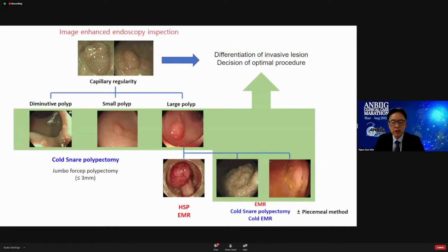Summarizing the recently published studies about polypectomy and EMR, the cold resection techniques are continuously expanding the indications for benign lesions without submucosal invasion, especially in consideration of safety and cost effectiveness. However, as several studies show the shallow resection and high rate of improper excision for pathologic analysis of the cold resection techniques, the lesion differentiation for invasiveness before the procedure is a very important step.